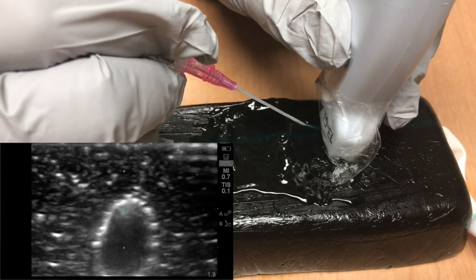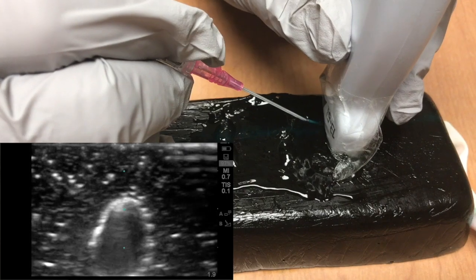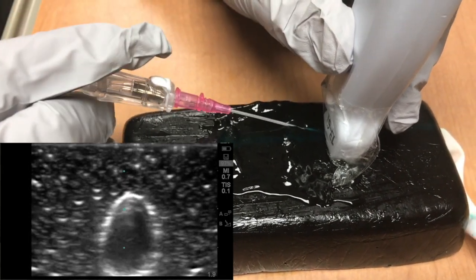To do this, after breaking the skin you should pause movement of your needle hand, find the tip of your needle using your probe hand, then slowly advance the probe hand and needle hand away from the skin puncture site until you see the needle tip enter the vein.